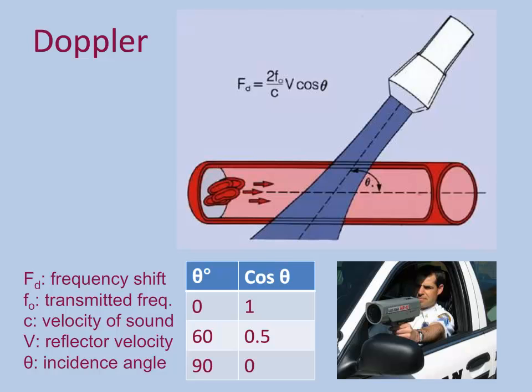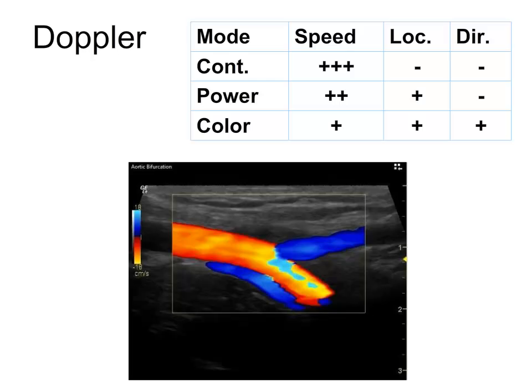That's why the police can only underestimate your speed when shooting their beam at you from the side of the road at an angle. And if you try to argue your way out of a ticket, be aware that most police officers are familiar with Doppler's equation principle and with the values of cosine theta.